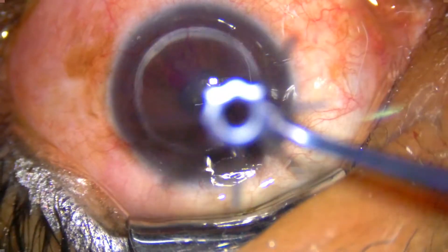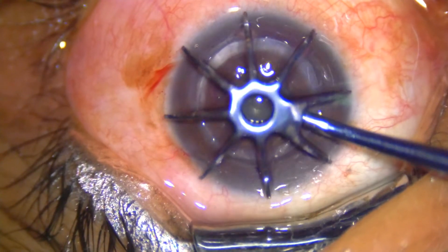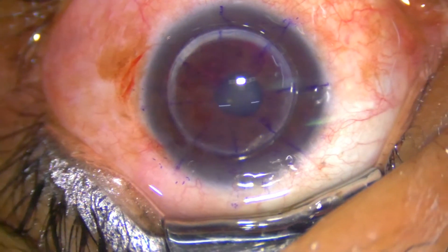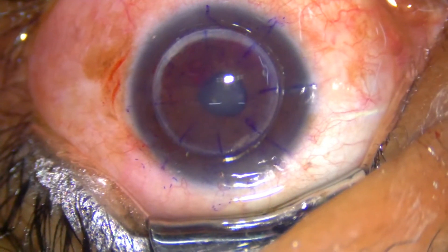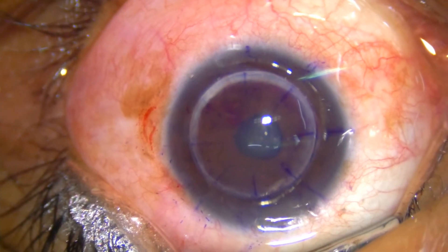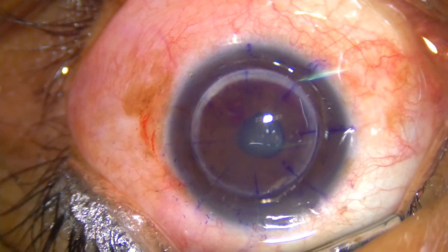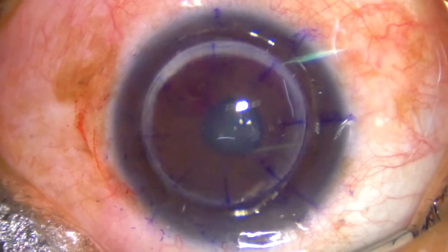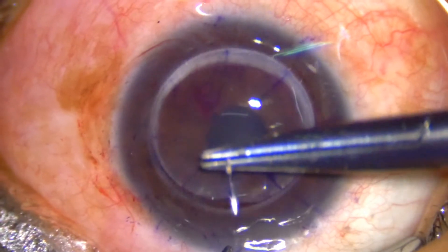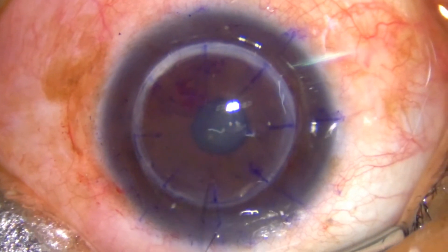Sloped margins can be troublesome for the graft-host junction and will induce unnecessary astigmatism. The donor tissue is 7.5 millimeters and the host size is 7 millimeters. I have placed the graft in place; the anterior chamber is quite well formed. I usually mark with an 8-tooth marker after this so I can get good orientation of sutures. I usually start suturing with 12 o'clock sutures, using specially made 2-tooth forceps, which gives a stable graft and prevents cyclo-rotation.